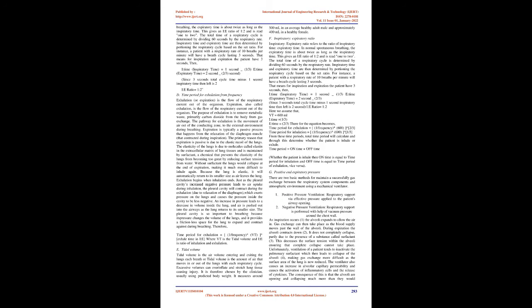Glass vent can be operated in three ways. The first scheme, i.e., manual operation, does not require any electronic component and accordingly the cost of the system is reduced to minimum. The second operation scheme, i.e., mains or battery operated, is the scheme with the most features. The heart of the system is the stepper motor driver printed circuit board, PCB, module, DRV8825 stepper motor driver carrier, high current. All inputs and outputs of the DRV8825 are connected to the brain of the glass vent system, i.e., Arduino Due.